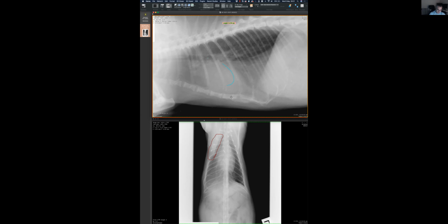Okay, what you are saying makes sense. So increased opacity, and you are saying you are not seeing vessels. Yeah. Okay, and because you don't see vessels, what you are thinking is this is fluid. The fluid is in contact with the vessels, like grapes surrounded by water. Therefore, I don't see them. Okay, yeah. I'm going to challenge you.